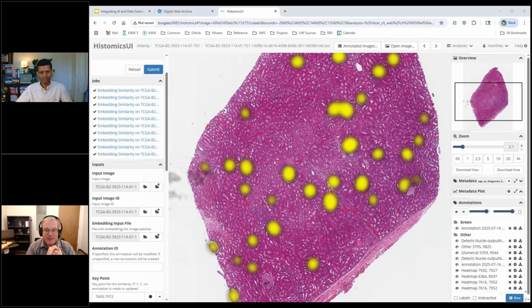I was actually trying to do that as an example of this before I used the foundational models, to see if I can get one of these models to explain what I'm looking at, because I'm not a biologist and I say, what is this region? And sometimes it made sense, looking at brain tissue and saying, hey, this is brain tissue and it seems to have neurofibrillary tangles. You're like, great, this is working great. And then you click somewhere else and it tells you something that is clearly not right. I can tell the difference between brain and liver. And sometimes you can see whether the multimodal models are working well or not.